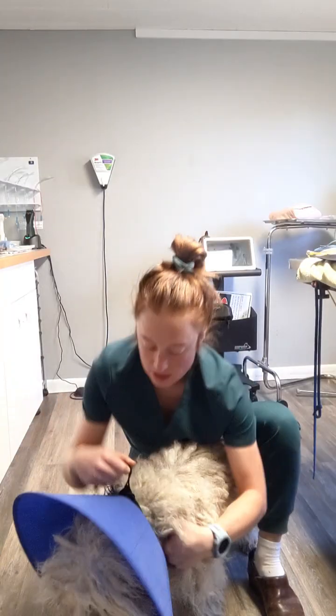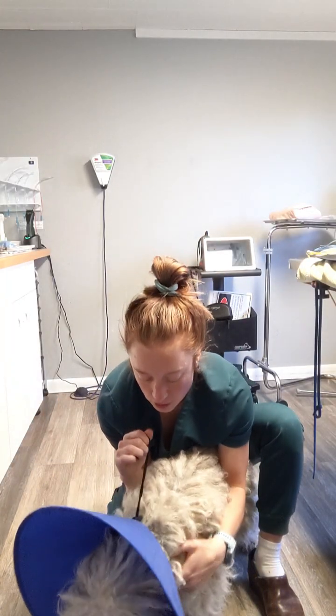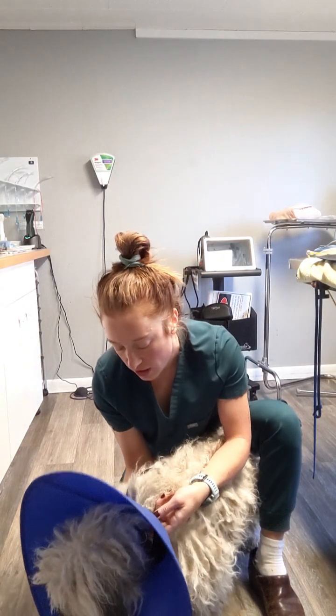And then this e-collar has just a clasp where you can tighten it, and then just making sure that that's not going to come off. I want it to be firm but not too tight. I should be able to fit some fingers underneath the e-collar, and then another option is I could attach it to her existing collar just to make sure she doesn't pull that off.